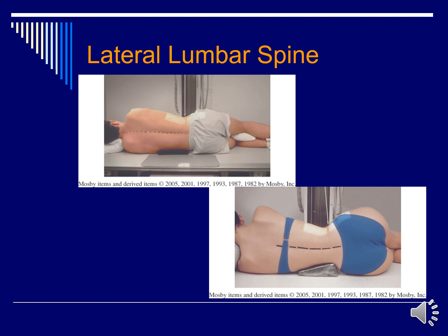So for the image at the top, that is a male patient, you see that with the support, the spine is now parallel to the image receptor. Thus, we can use a perpendicular beam and not place an angle on the tube. So it's still going to be a 40-inch SID at the iliac crest and mid-coronal plane. You want to collimate anterior to posterior so as not to get too much soft tissue of the abdomen, but keep your head and toe open to the 14x17.